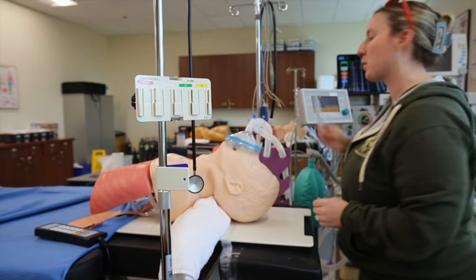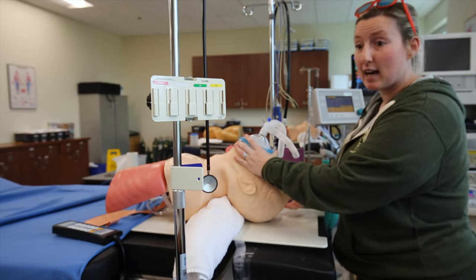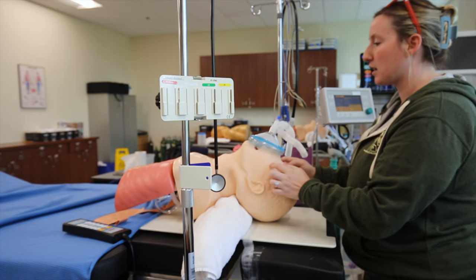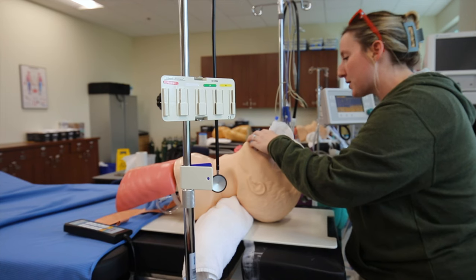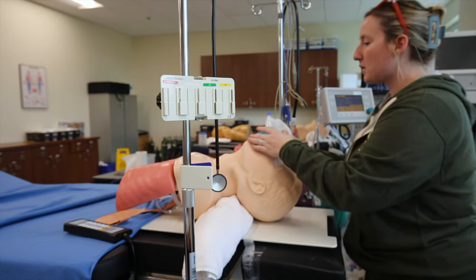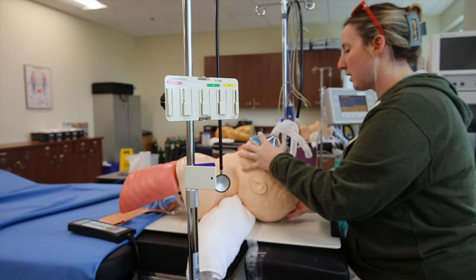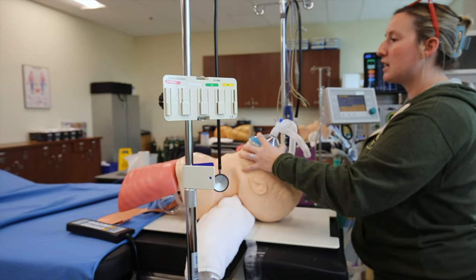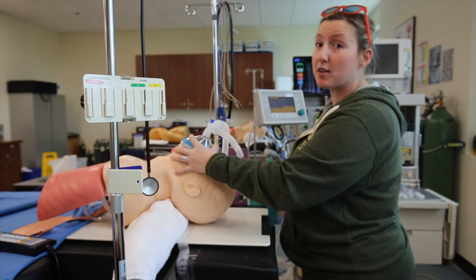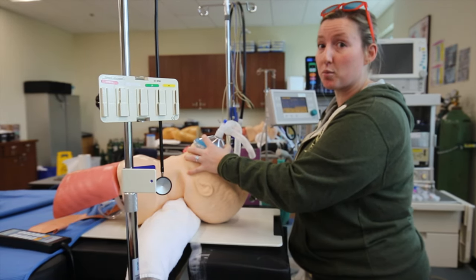I'm going to push my propofol. At this point we should be seeing his face relax — we might have a dip in end-tidal. Once that face relaxes, we're going to do some noxious stimuli: 'Hey Joe, are you awake? You with us?' No response. I'm going to stimulate a lash reflex, and if he does not have any reflex, I'm going to protect him and tape his eyes. I'm going to attempt to ventilate — APL to 20, good head tilt, chin lift. I can see chest rise and fall, misting in the mask, and a good end-tidal. I've established that I can ventilate, so I feel comfortable pushing my paralytic.